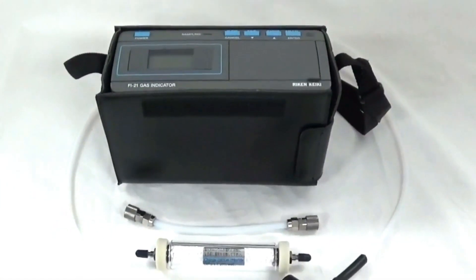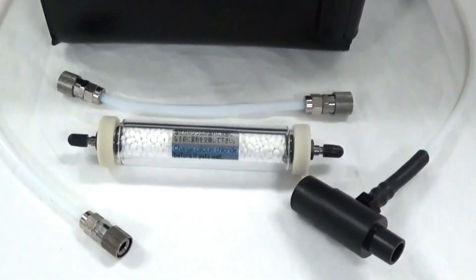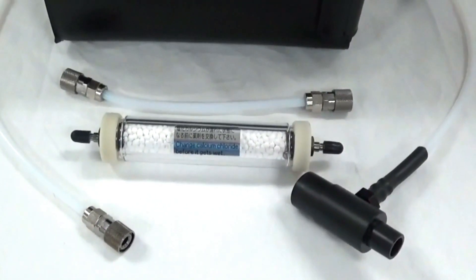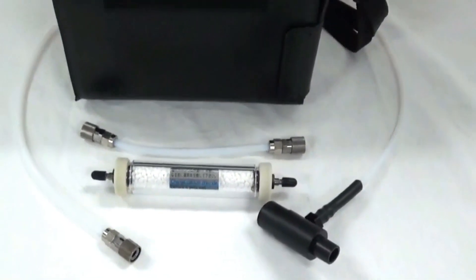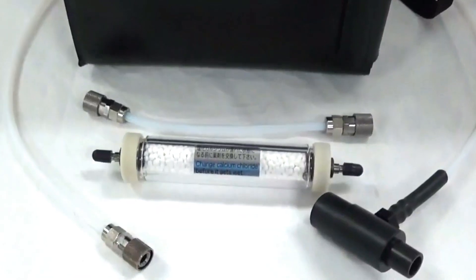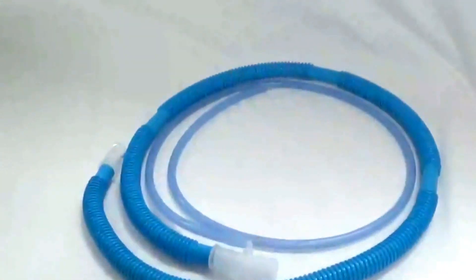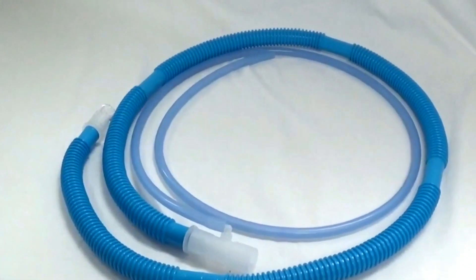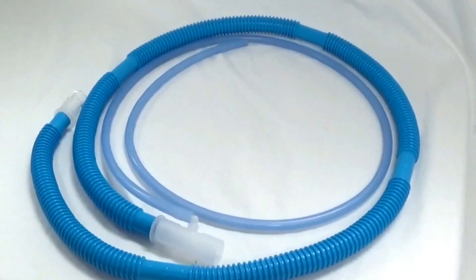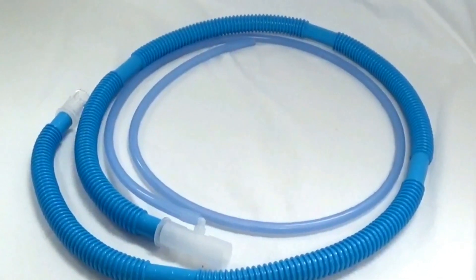This is the Riken Fi21 gas analyzer, which includes a 6-inch Teflon tube with Quick Connects, a calcium chloride filter, and a 3-foot Teflon tube with a Quick Connect and a gas sampling tee. We will also be using the Riken gas scavenging kit, which includes a 5-foot quarter-inch silicone tube with 19-millimeter tubing teed in to connect to the clean air canister.